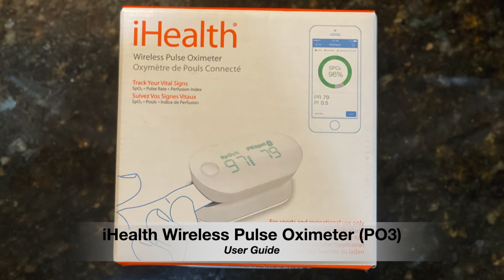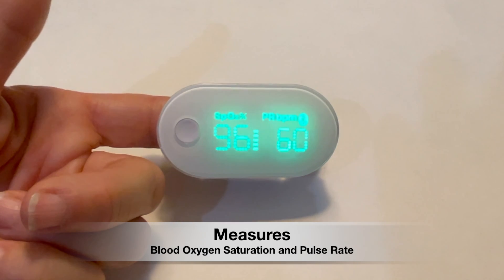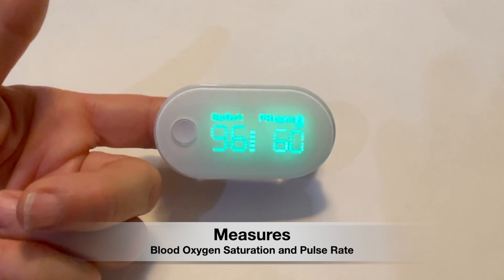In this video, I explain how to set up your iHealth wireless pulse oximeter, properly take a measurement, and upload the data. This device measures your blood oxygen level and your pulse rate.